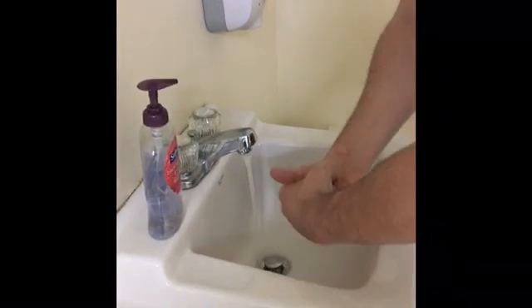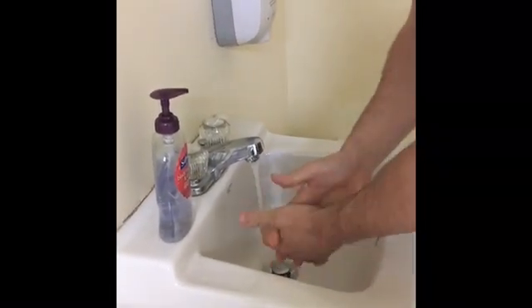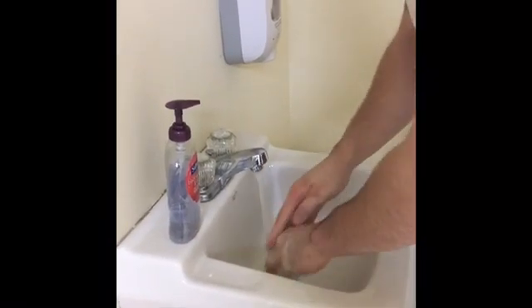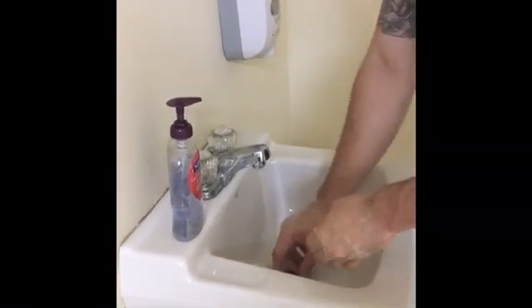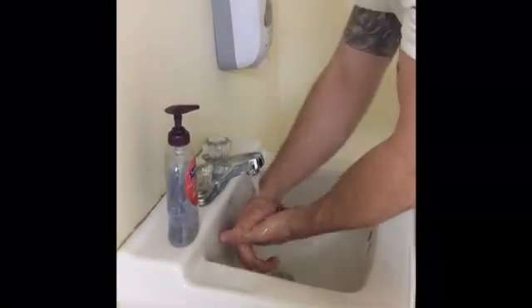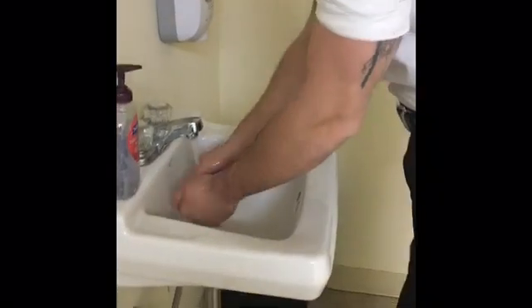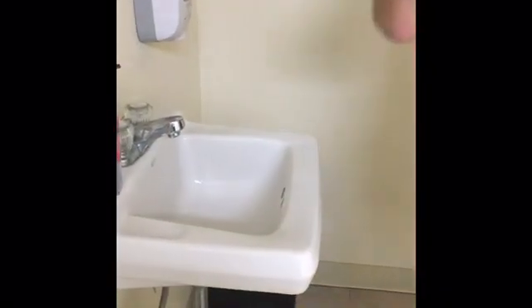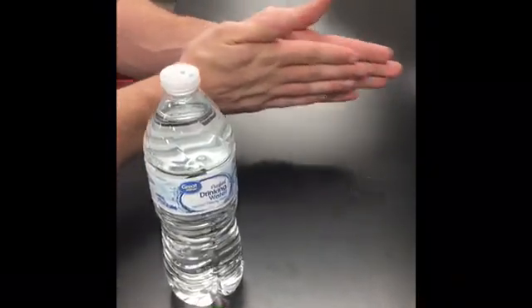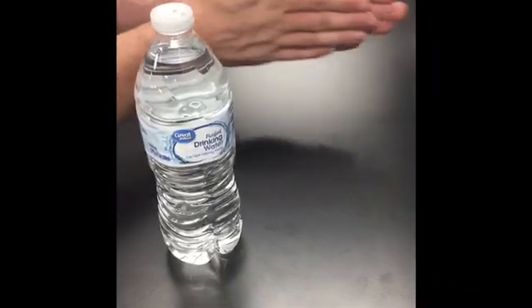Next, you will wash your hands with warm water and soap. Dry your hands thoroughly with a clean paper towel. Rubbing your hands together for 10 to 15 seconds will increase blood flow. Staying hydrated prior to testing will also assist with sample collection.